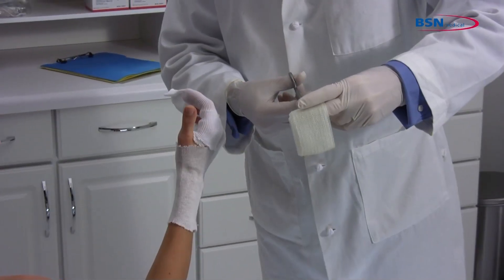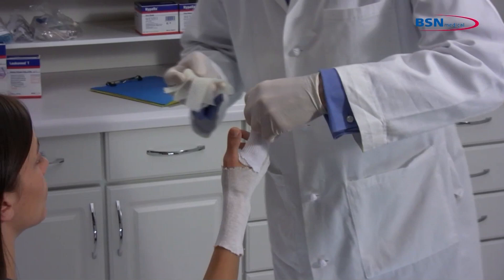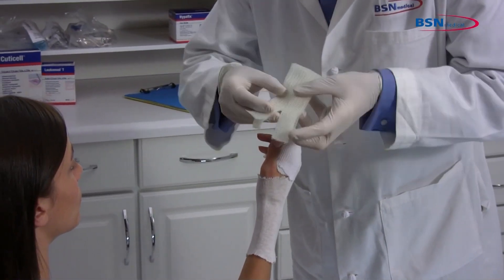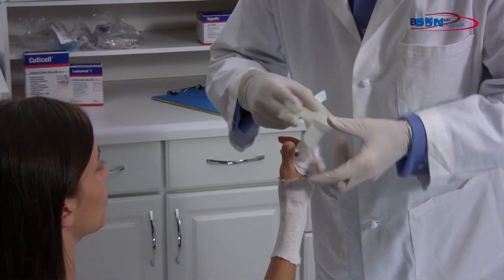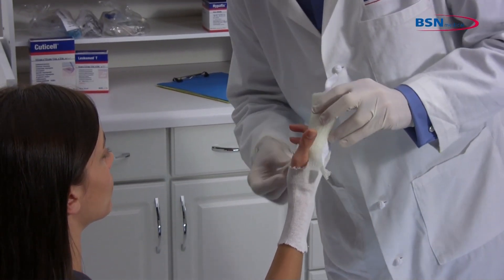Cut approximately two inches in the middle of one end of the reinforcement strip to create a split end. Place the reinforcement strip along the lateral side of the second phalange so the split end goes around the thumb.